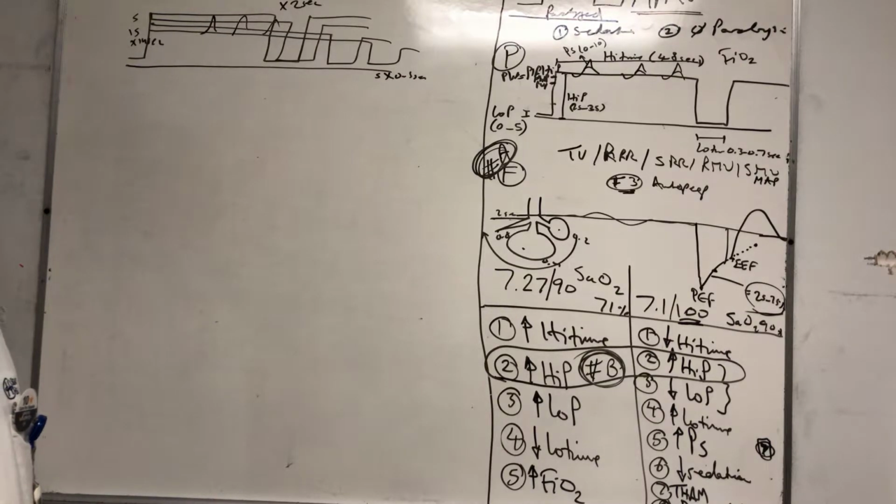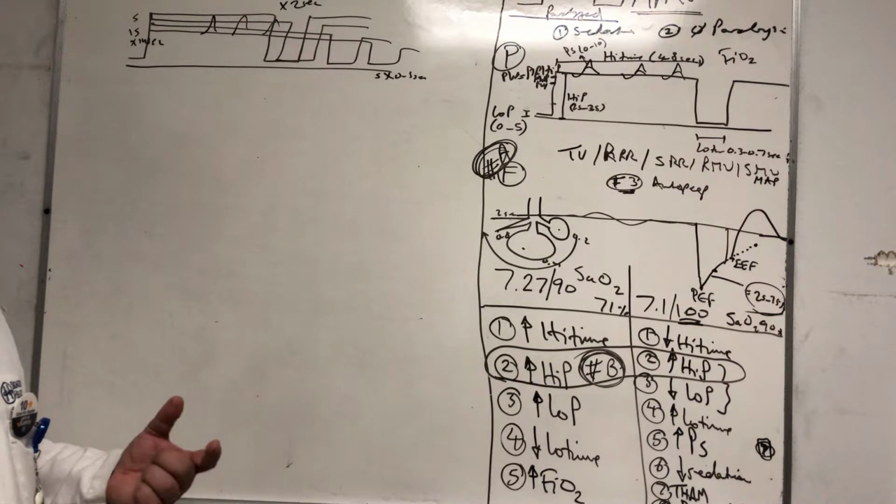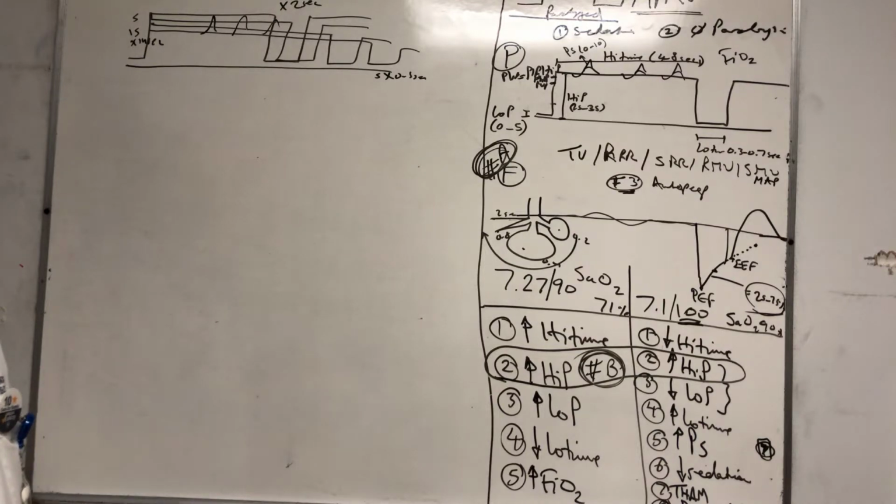But of course, we didn't reach that. No hospital reached that level where you actually extubate directly from APRV. So we have to switch to pressure support. We have to switch to the SBT mode of ventilation. Or we have to tell the respiratory therapist when it is suitable to start doing SBTs. We told them don't do SBTs, right? Now we're saying, okay, now you can do SBTs.